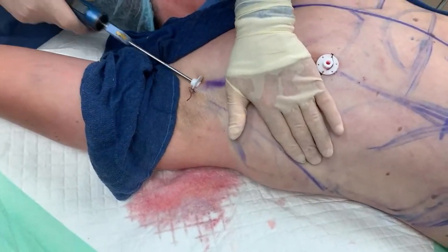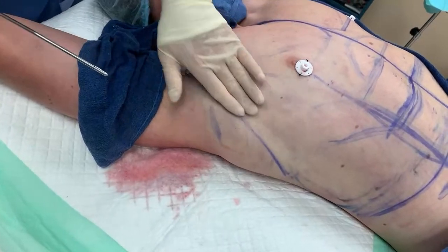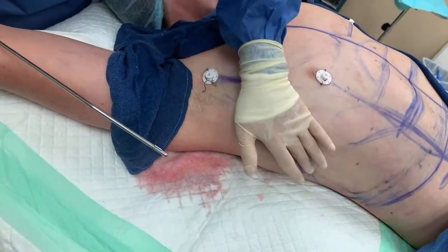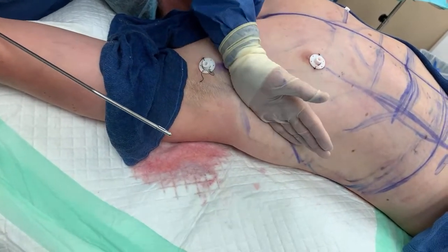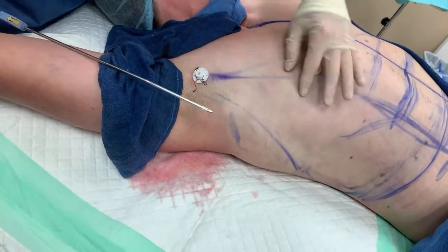I'm moving his arm way up, almost dislocating his joint here. See what I'm doing with the lats? It's showing the lats beautifully. I want to keep the volume here, but I create lines and then shadows — lines by the lats, lines by the pecs, and then shadows between those two.